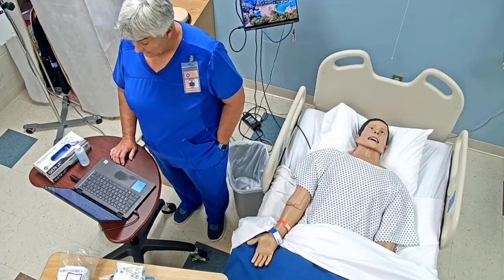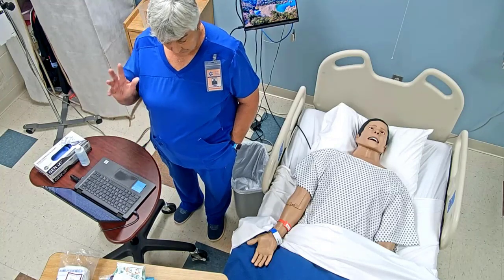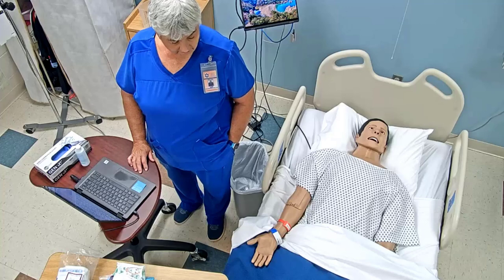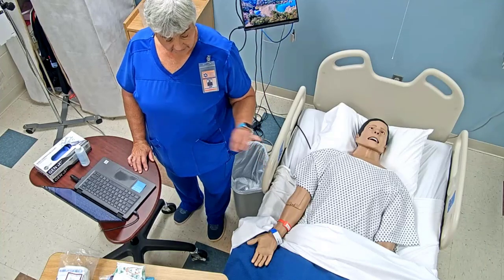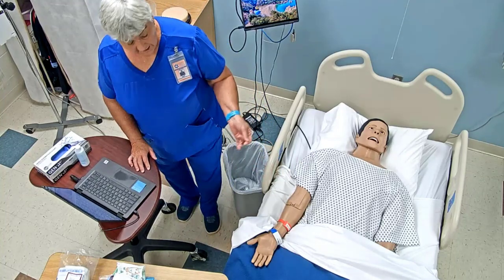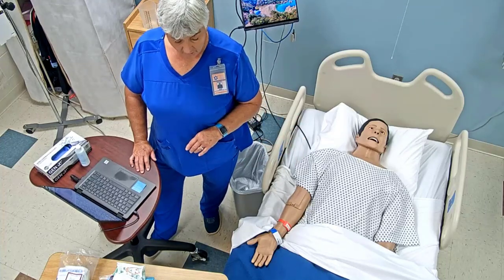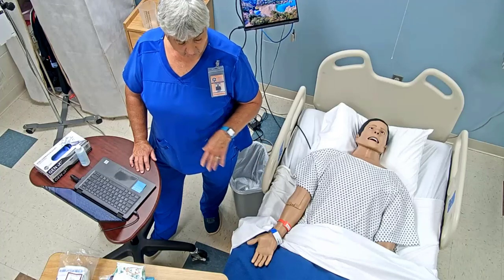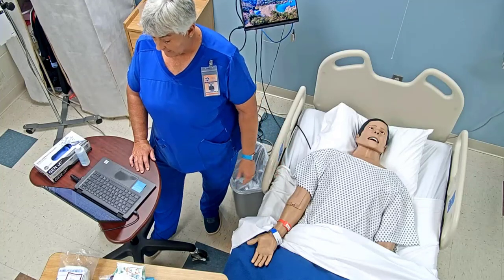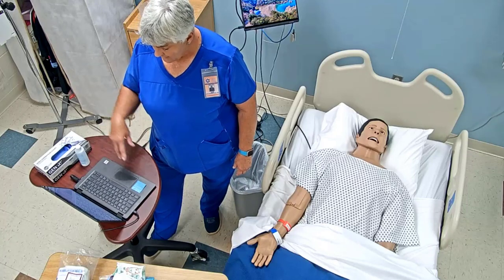I'm also going to be looking at the policy and procedure, checking specifically the technique, and whether there's anything about a male, since sometimes it may be difficult to put a Foley catheter in, maybe because of an enlarged prostate. And so how many attempts can I do before I would need to stop and call the physician, let the healthcare team know, and then let the doctor know. That would be an unexpected, abnormal thing that we potentially could have here. So, done all of that.